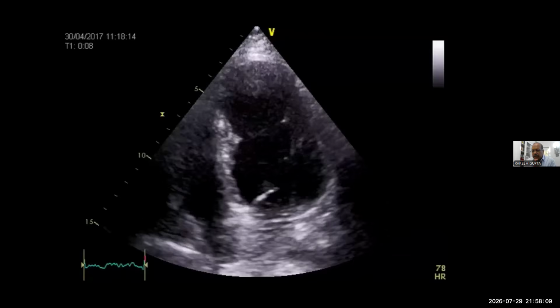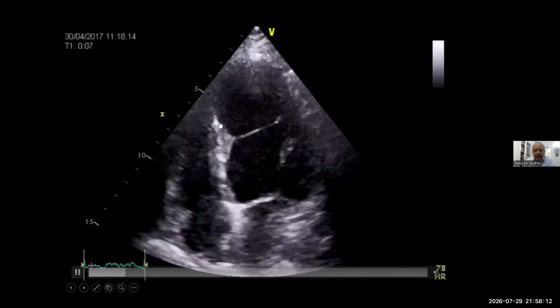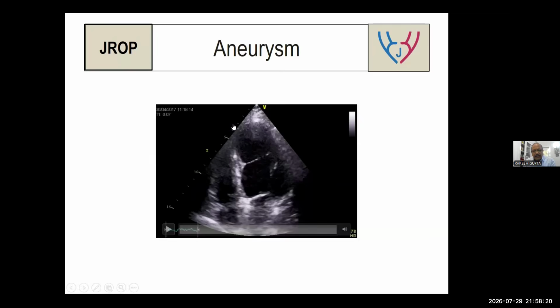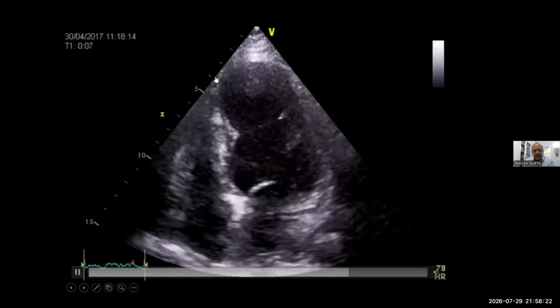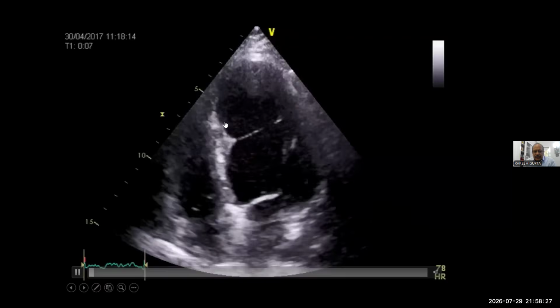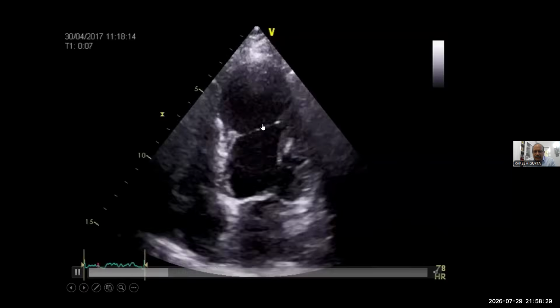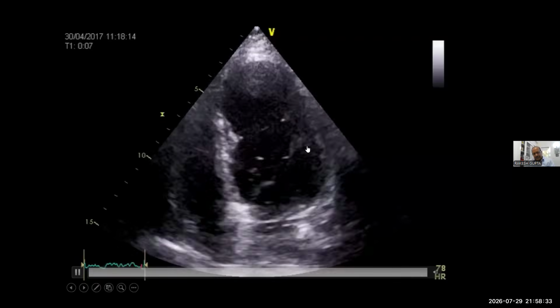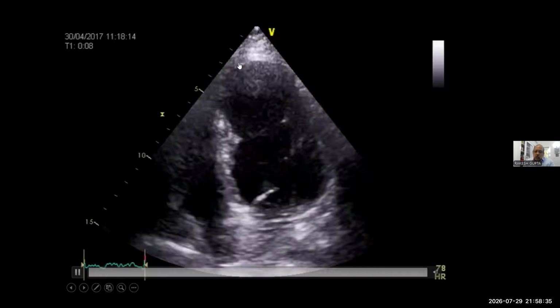Look, if you look at this kind of segment, apical septum, apical lateral along with apex, it virtually shows ballooned out segments. See it carefully. This segment has got thinned out. This is exclusively the part which is seen over here. Look, this part is contracting, this part is contracting. This is known as true aneurysm.